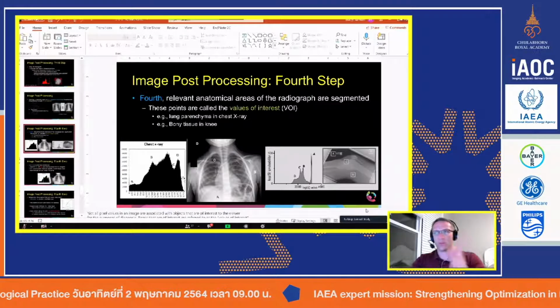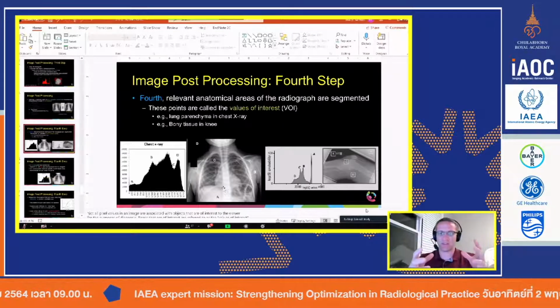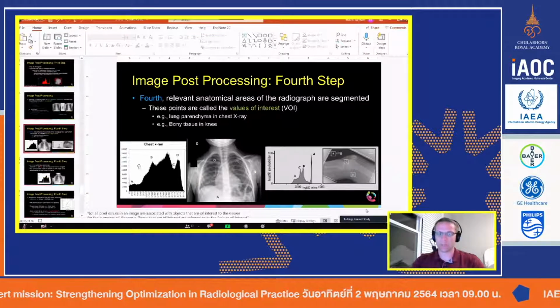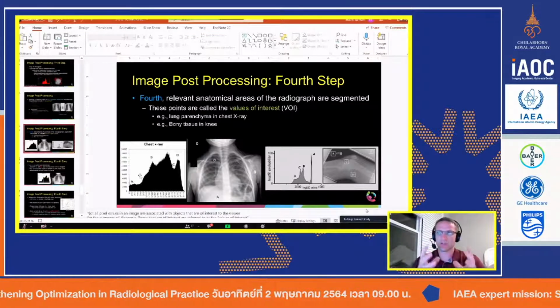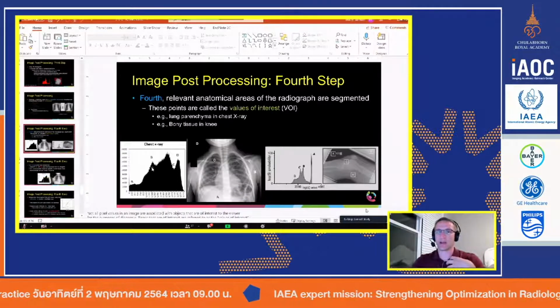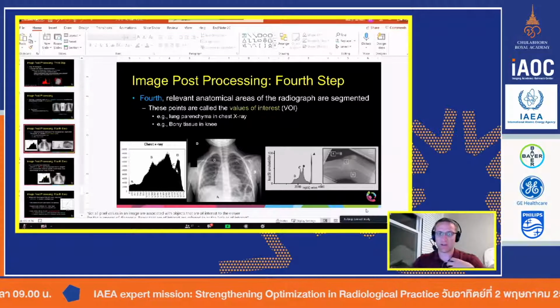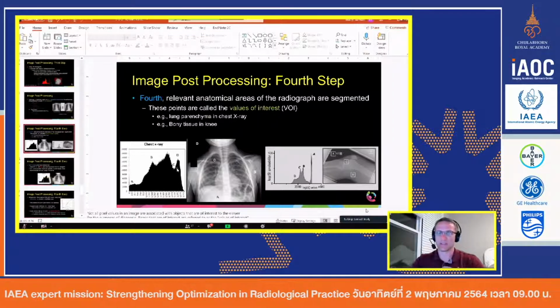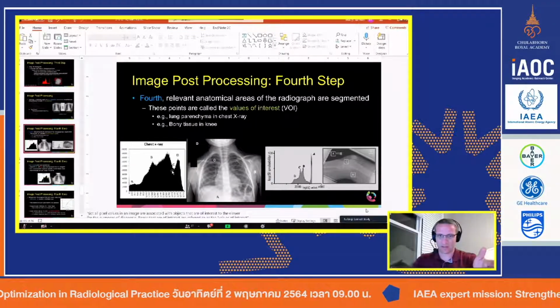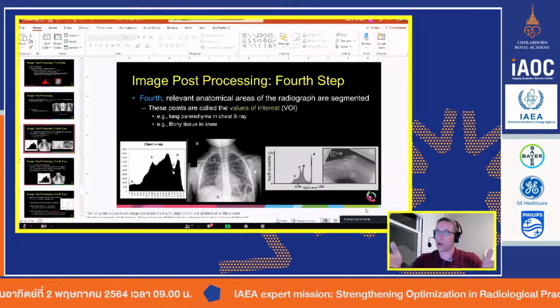Now, obviously, women will present with breast tissue, and if they have denser breasts, or depending on the age, the breast tissue may be located slightly differently. That will add a little bit to it, but the major structure of the histogram will be the same. Remember, in the chest radiograph, we're most concerned about the lung fields, so we're looking at this region right here in the histogram. For the most part, that is always the same. As an example, you can see these two histograms are very different. An abdomen would be different than a chest, but kids to adults are largely the same.